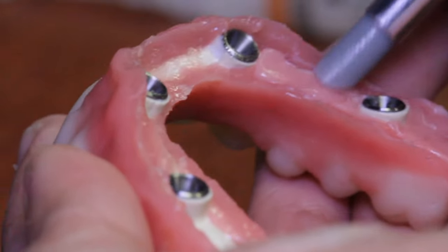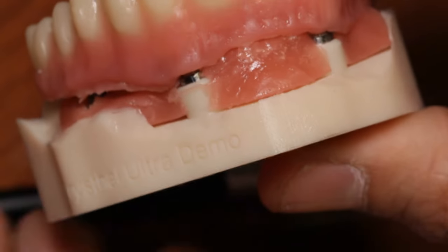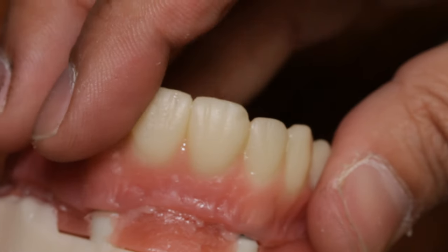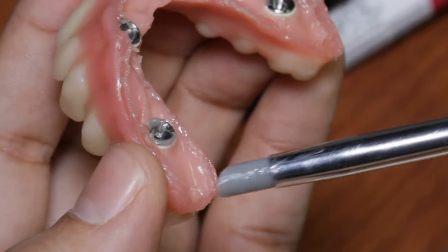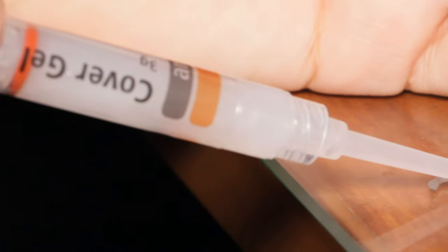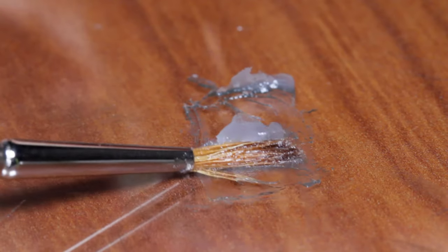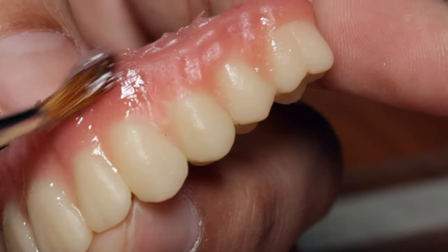After applying the material, I press the device back onto the model to ensure a snug fit. Then, using a silicone flat tip and Model LC liquid, blend the junction seamlessly to avoid any gaps or imperfections. The goal is to achieve a smooth surface overall. After that, it gets light cured again for five minutes. The transparent cover gel is spread across the entire surface of the pink for a final curing cycle, eliminating the inhibition layer — that's the sticky layer on the surface — and ensuring thorough curing of the restoration. This step is crucial before proceeding with any polishing or glazing.